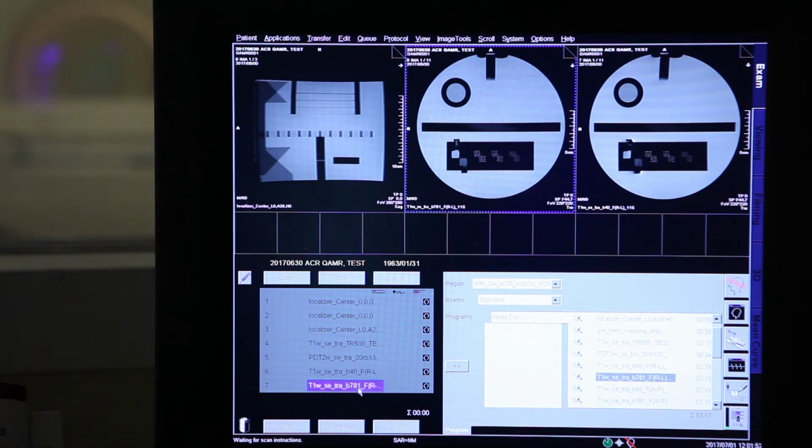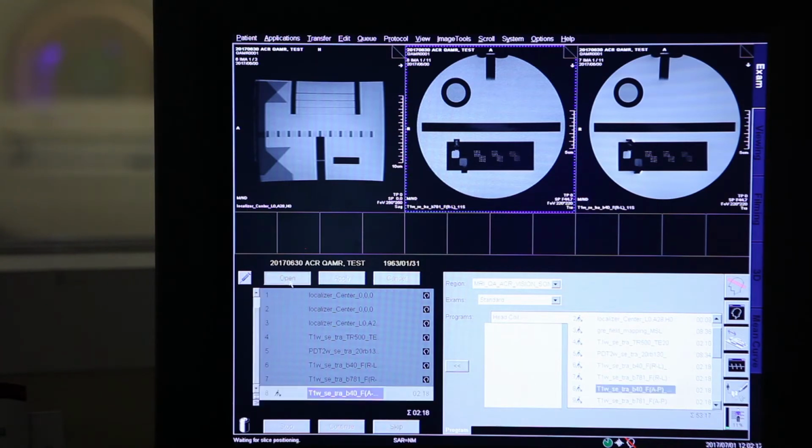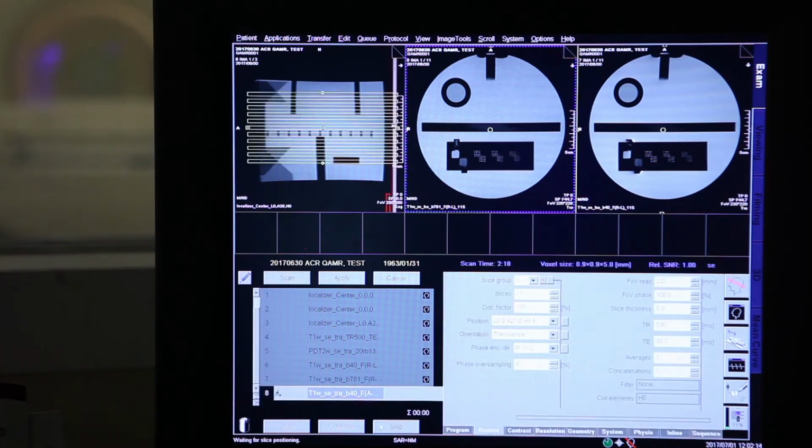Now, we did it for one direction, the right-left direction, because the frequency is there. In order to fulfill the measurement, we have to use the other axis, the y-axis. So in the y-axis, we already have the sequence. Now the frequency is on the AP axis. So we need the second pair of T1 sequences with shifted frequency direction.